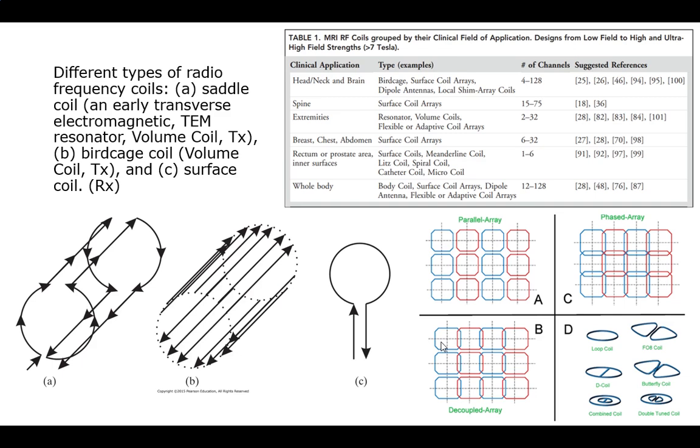These tend to be transmit coils. This is a receive coil, right? We often do dedicate them. You can make them bidirectional. If you do, it's probably one of these. These ones really stink for transmission, but if you stick them right next to the body, they're not too bad. So you're only going to do transmit-receive if they're really close to the body. If you're on the inside of it, it's going to be one of these, because you're not trying to receive back on them, because that's just going to be ugly.